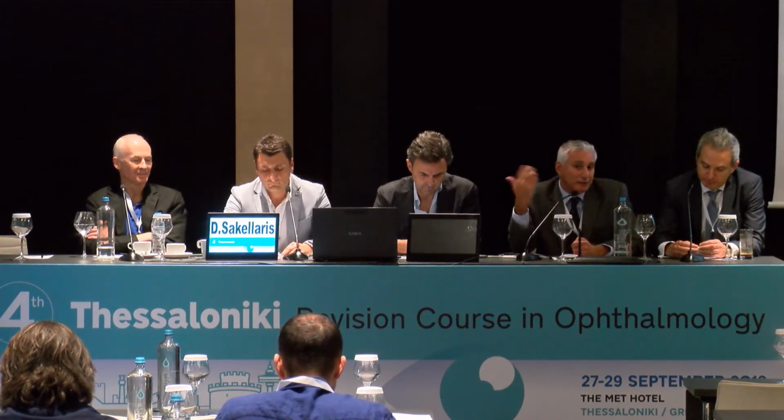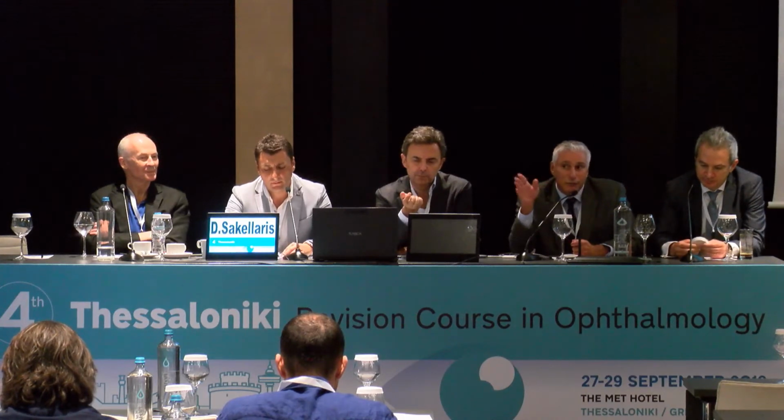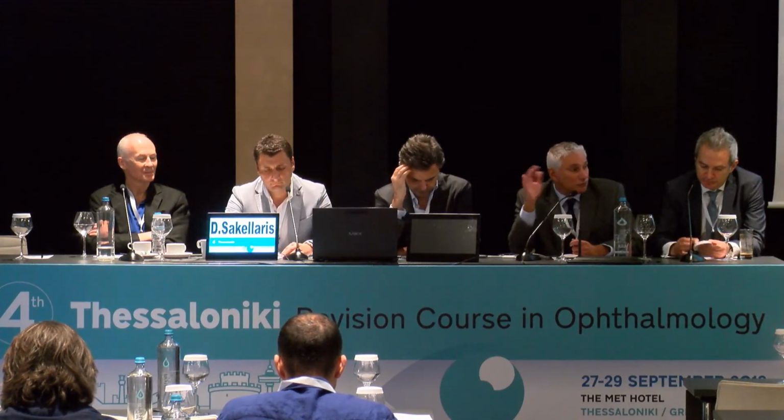Part of it may be the additive effect that the ring has. And in this particular ring, because I'm not talking about Intacs, Intacs, I don't think they have the same effect as that Kera ring. Kera ring is a different story, I think. Yeah, we should exclude Intacs from our discussion from now on, because Kera ring shows an effect.